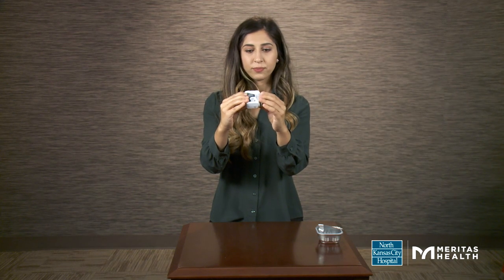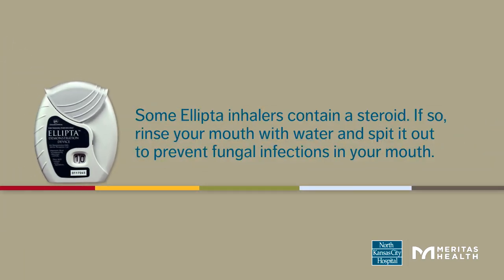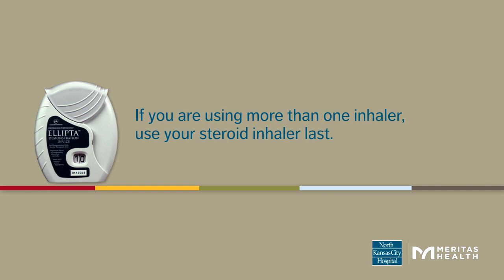Slide the cover over the mouthpiece. Some Ellipta inhalers contain a steroid. If so, rinse your mouth with water and spit it out to prevent fungal infections in your mouth.